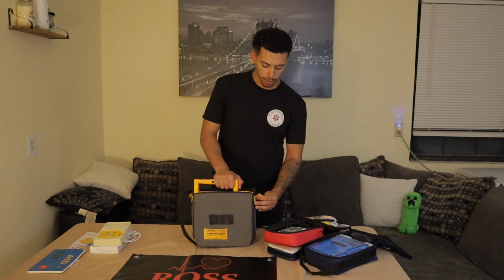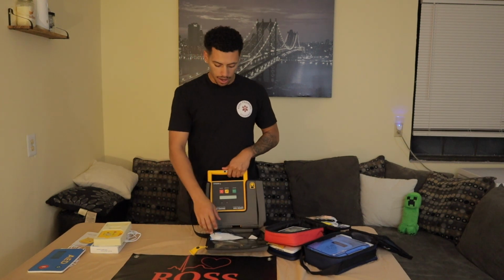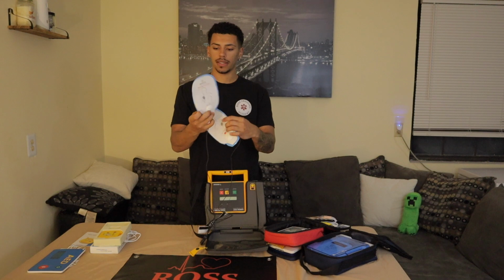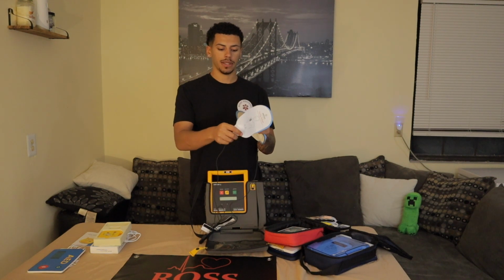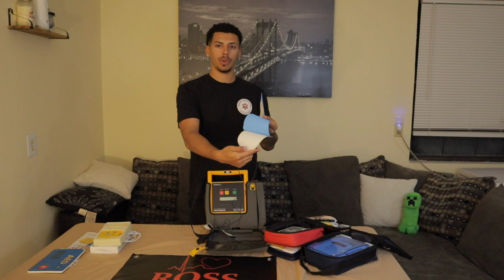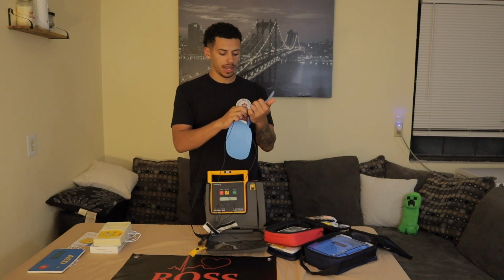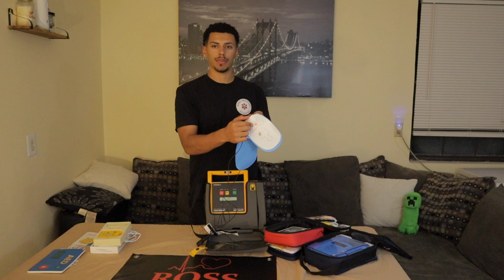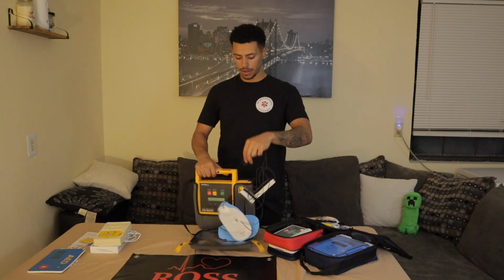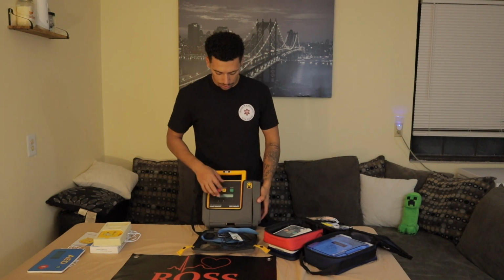So let's go ahead and open it up with these two snap buttons on the side, and then we just have this. I only have the adult pads that come with it, and they're huge. They look just like this, kind of like a laminated paper with the diagram printed on there. You pull this blue plastic off, and then place it down on your patient. Then it has these wires, which aren't really connected to anything, just adhesive stuck onto the front of the pads. And then it has a little plug that plugs into the top of the device. Let's go ahead and turn this thing on so you guys can hear the prompts.